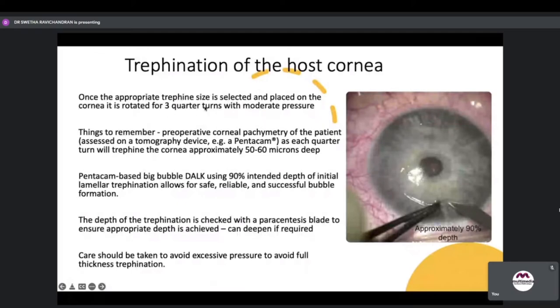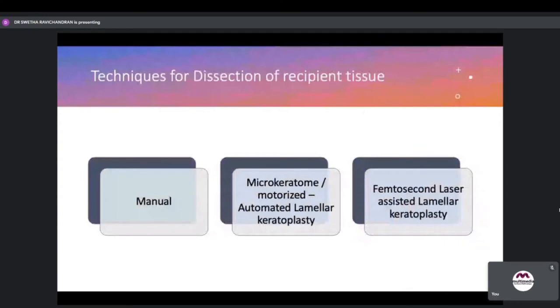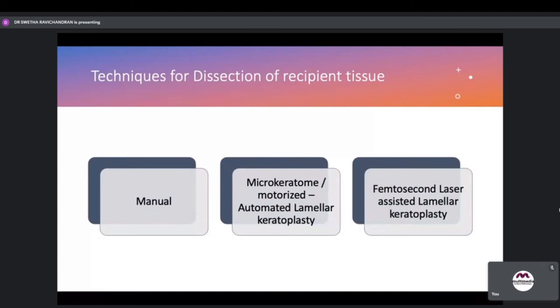Once the trefine is centered, it is rotated. For vacuum-assisted trefines, rotate three-quarter turns with moderate pressure, keeping in mind the pachymetry from PENTACAM or other devices. If using PENTACAM-based big bubble DALC, you can go up to 90% of the intended depth in the initial trefination. The depth of trefination can be checked with a paracentesis blade. Techniques for dissection of recipient tissue include: manual dissection layer by layer, microkeratome or motorized automated lamellar keratoplasty, or femtosecond laser-assisted lamellar keratoplasty.